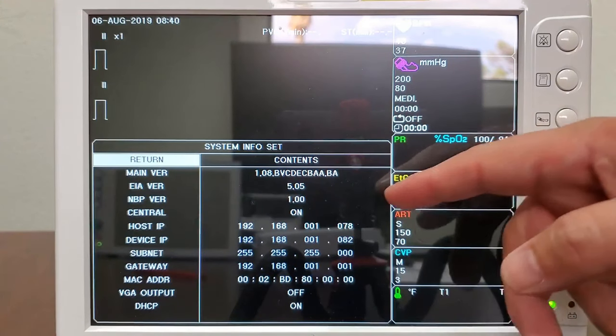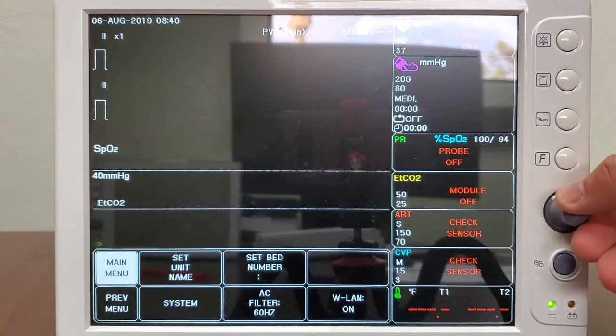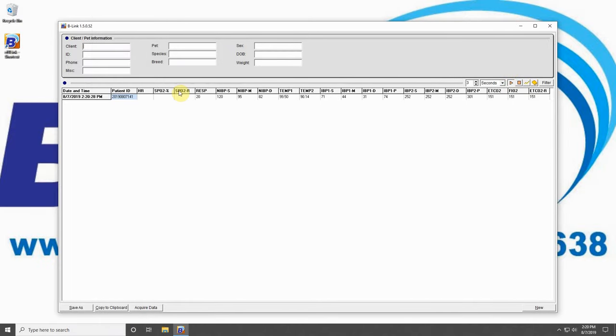Input your computer's IP address under Host IP. Exit out of all menus and power cycle the unit. On your desktop with B-Link, press the triangle button, and the data appearing below indicates a connection between your BM5 VET and B-Link. Congratulations!